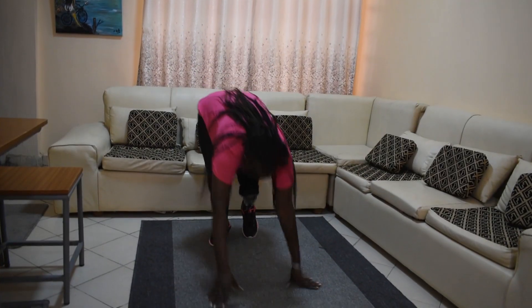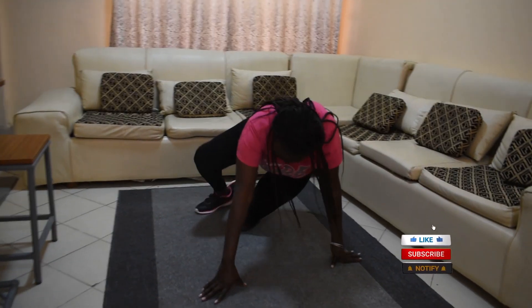Falling and rising with a prosthetic leg. How do you wake up after a fall?